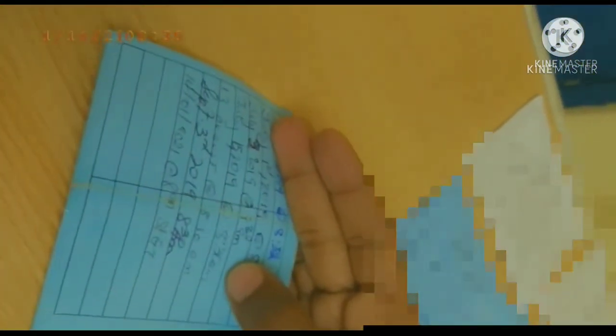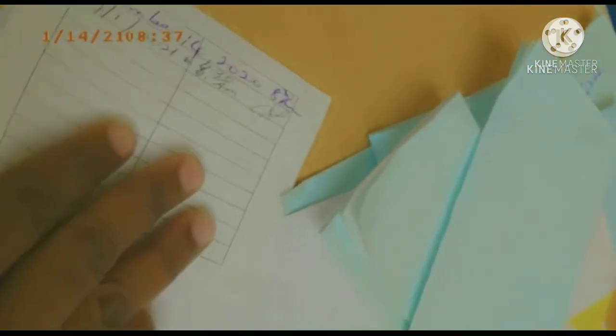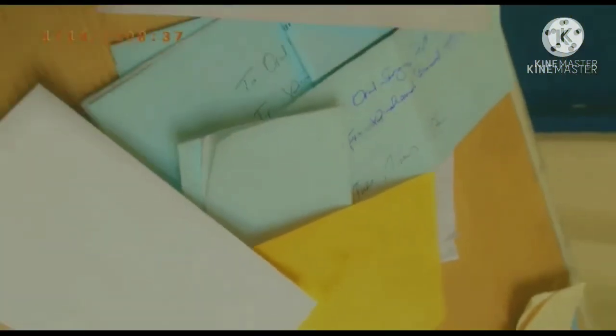So this is a patient who is here for surgical extractions. After I see those persons who have surgical appointments, I would then ask them if they have an x-ray. If not, I will go ahead and do an x-ray. I'll also show you that in another video when I'm doing the x-rays. After I'm finished with the appointments, I'll go ahead and look at the referrals. These are persons who came in without an appointment, who have referrals for trauma, irreversible pulpitis, wisdom tooth extraction, pain, swelling.